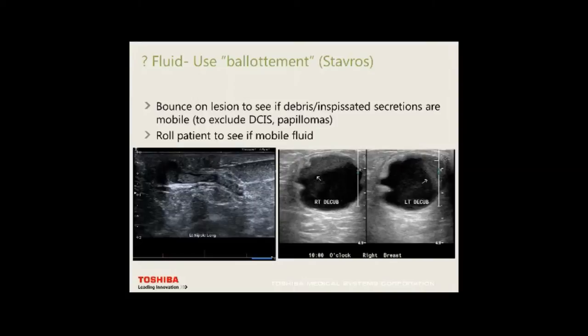In this case, the patient had DCIS. You may roll the patient to see if there's mobile fluid. Here we have a fat-fluid layer — this is a galactocele where fat is higher and the milky product is lower. Galactoceles are milk-filled cysts, usually in lactating women, and can be echogenic or hypoechoic depending on the fat content of the milk.